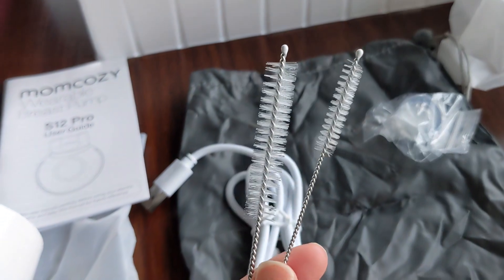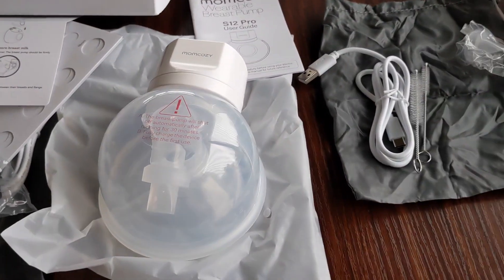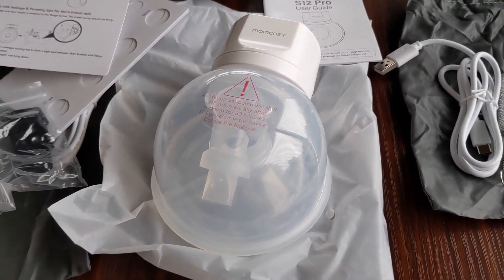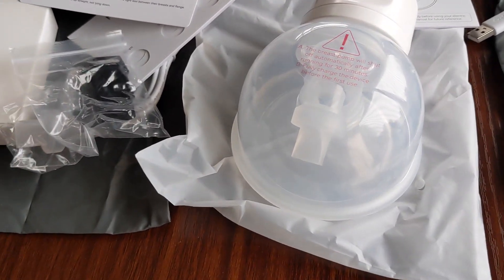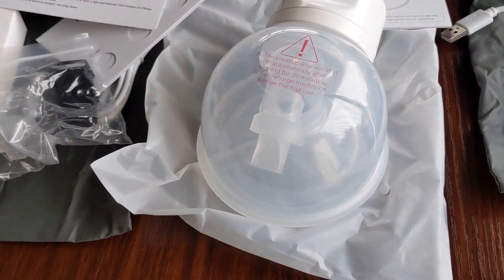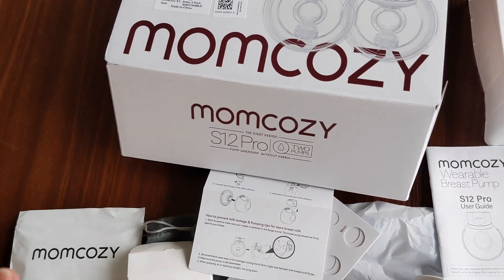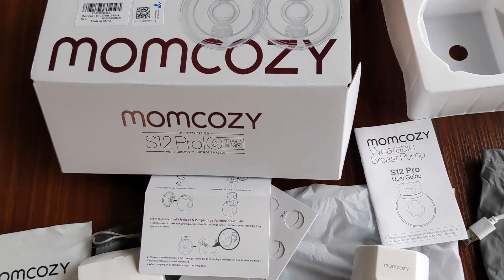It also came with two cleaning brushes, so it looks pretty complete. I can't wait to try it. Both Willow and Elvie are very expensive — I think they both run about $560. With this, using my baby registry completion discount, they were about $130, which is much more affordable than either Elvie or Willow.